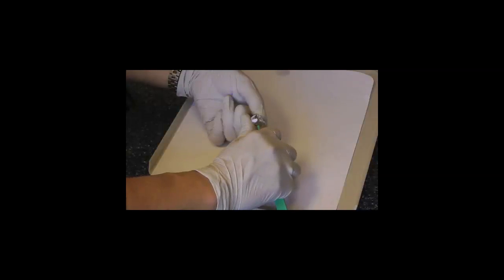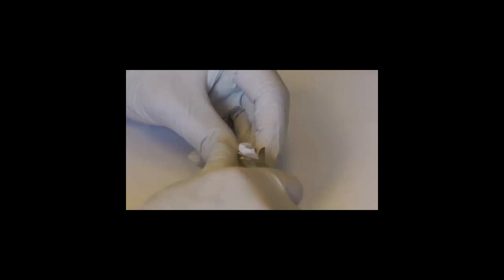Next I'm going to trim all of the excess material — the bite registration paste that extruded out beyond the parameters of the plastic Lucia jig or anterior deprogrammer. I don't want the patient occluding on the bite registration paste or that getting in the way of smooth movements when they go from right to left or into protrusive.